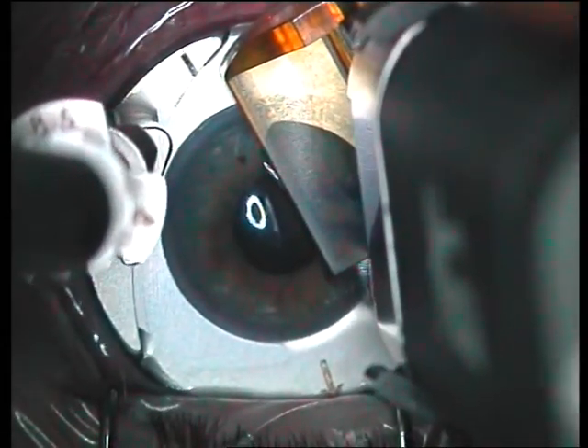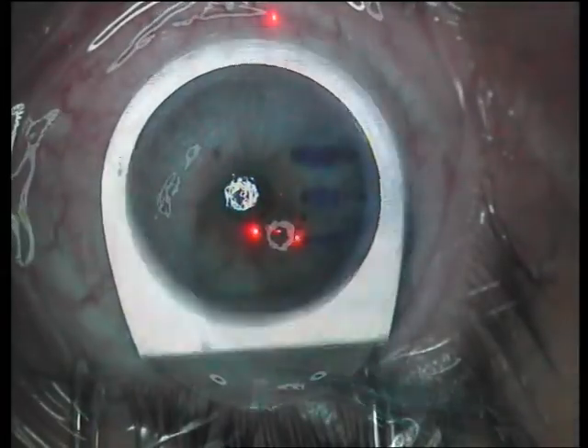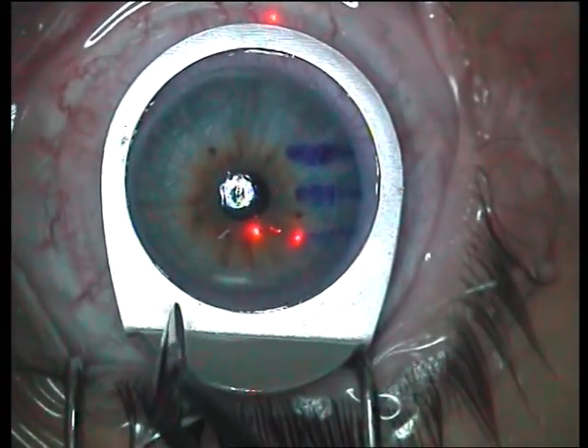The head is placed on the ring, the ring is locked in position and the head is advanced. The head is now reversed, unlocked, removed from the ring, and the suction is stopped and the ring is removed off the eye.